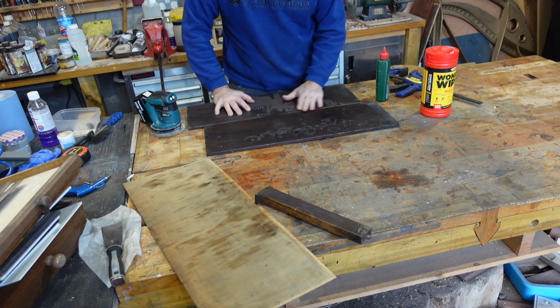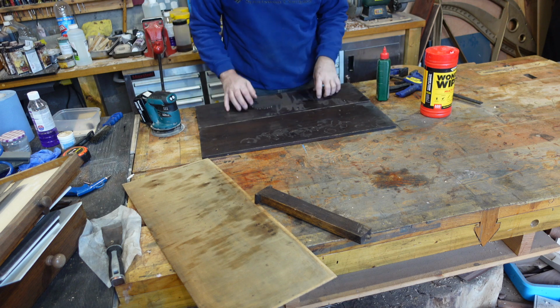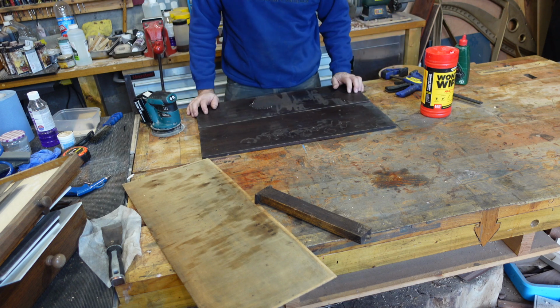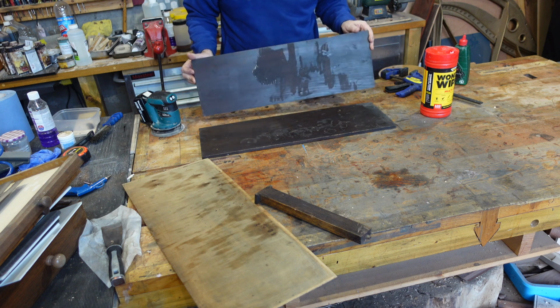So I'm now going to sand and tidy up these shelves, just give them a quick sanding and see what the colour comes up like, and maybe just put a little bit of finish on. These are the internal shelves, but they've got marks on them.